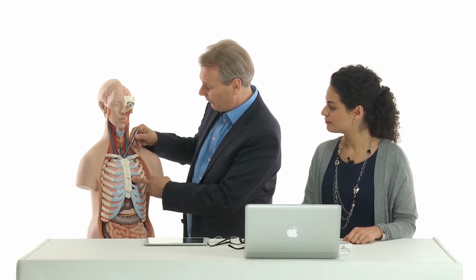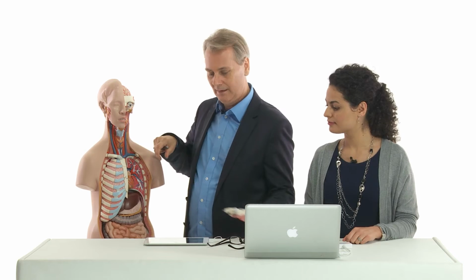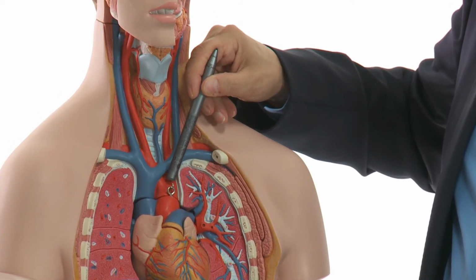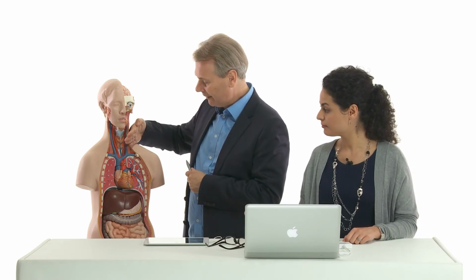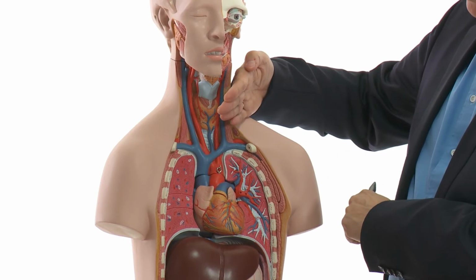So we'll be imaging from right here, looking down towards the aorta. Why are we imaging the aorta from here? Well, I have to show you if I take away his lungs. So from up here, we'll be seeing the aorta. And we'll want to see how the flow is actually in the descending part of it and in the aortic arch. Yes, the transducer, you have to remember, has to stay parallel to the vessel and the marker will point up. So this is about the orientation you have, because remember the ascending aorta goes to the right and then it curves down and caudally to the left. So this is about the orientation you have to have.